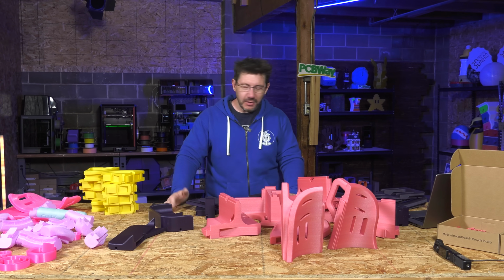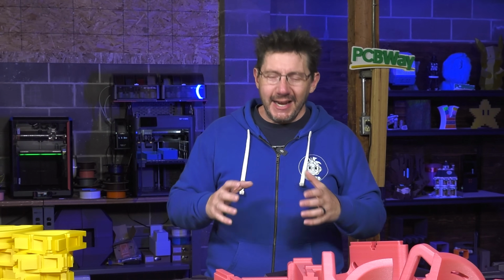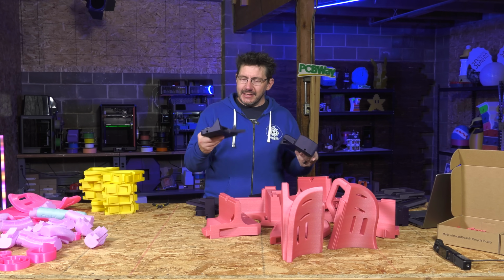I think I got the supports off of everything, and I think I bled a minimal amount. Just a flesh wound. You really get a sense of the joy and the kindness that went into these sorts of designs, because this is how they work.